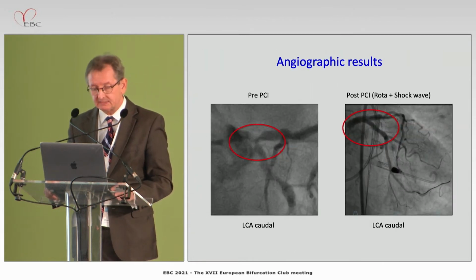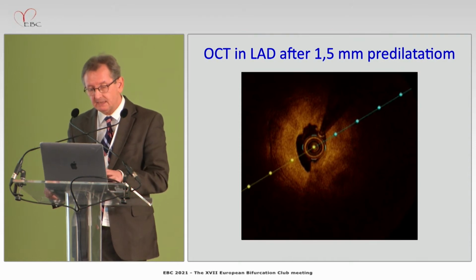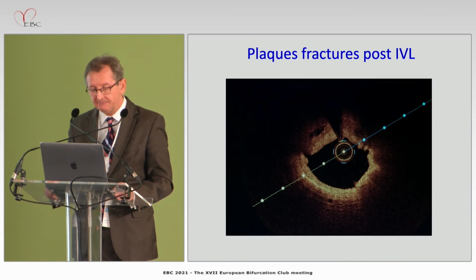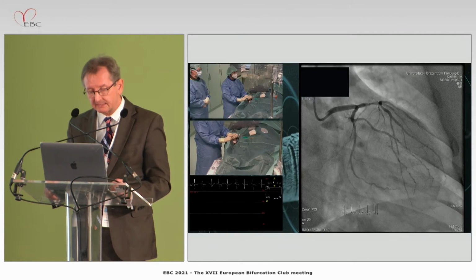And this is just an example for this. This is the left main after rota shockwave treatment. And this is a case which I present, severe calcification in LAD. And what we want to achieve, as Holger just nicely showed, these fractures in the plaque, and also to achieve really good stent expansion.